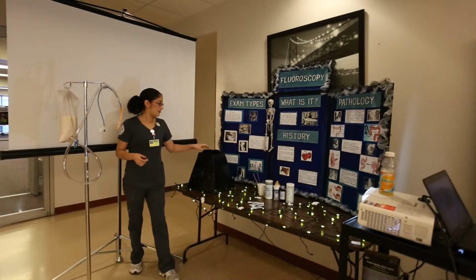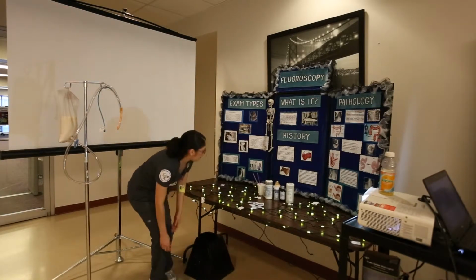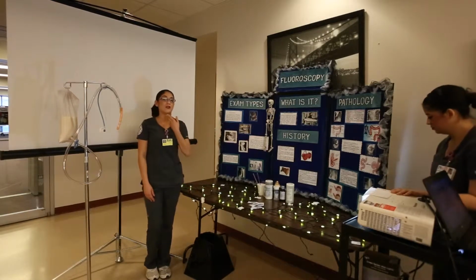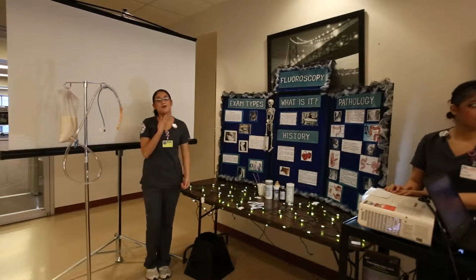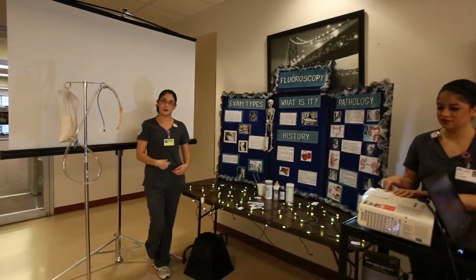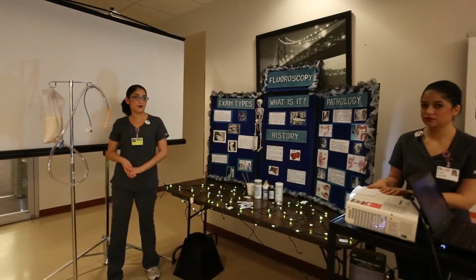Our last and final study is the esophagus study. The purpose of the esophagus study is to highlight the esophagus itself. So we'll have the patient drink it, and we'll see it in real time go from the mouth all the way down the esophagus to the stomach. That's pretty much basically it.